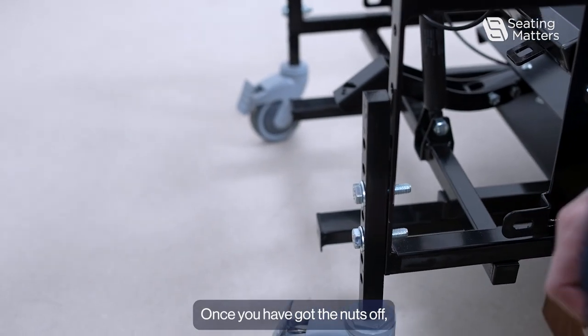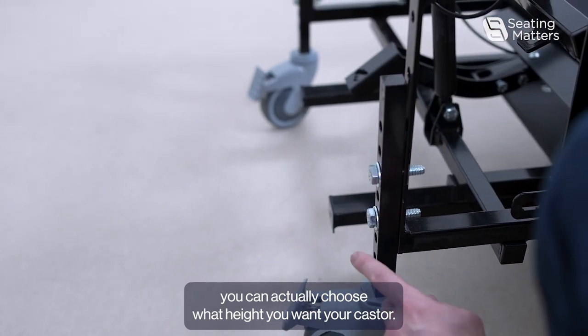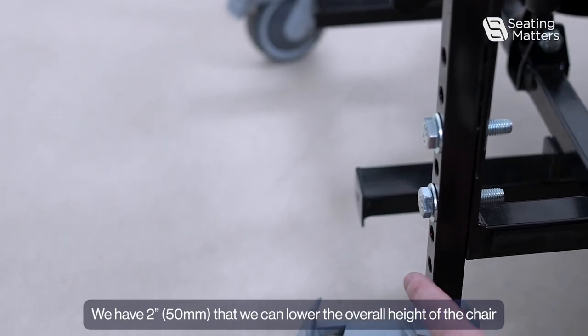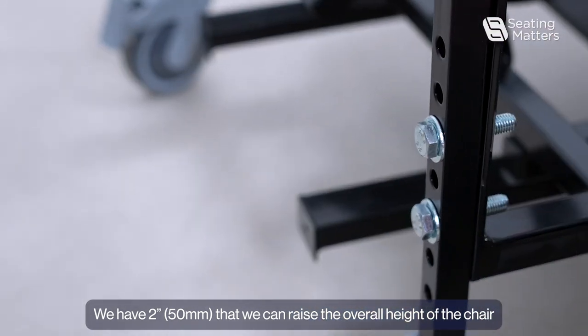Once you have got the nuts off, you can choose what height you want your caster. We have two inches that we can lower the overall height of the chair, and two inches that we can raise the overall height of the chair.